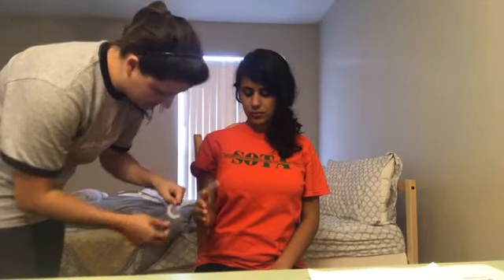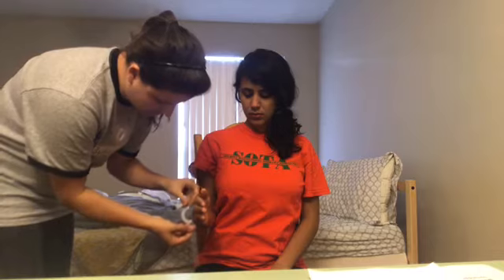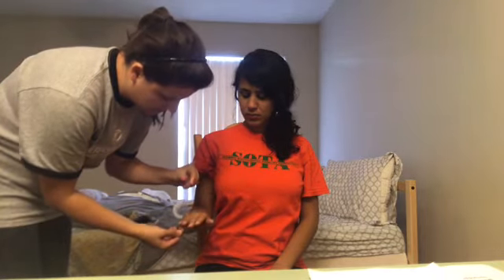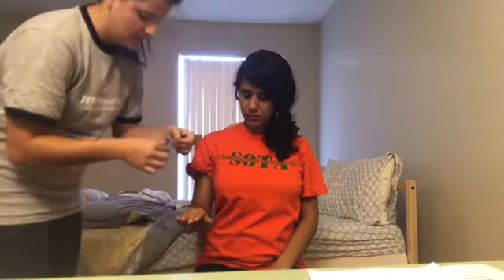This is range of motion for forearm pronation. The axis is going to be placed on the ulnar styloid process. The stationary arm is going to be perpendicular to the anterior midline. Perform pronation. The mobile arm is going to go across the dorsal surface of the forearm, and it is 80.